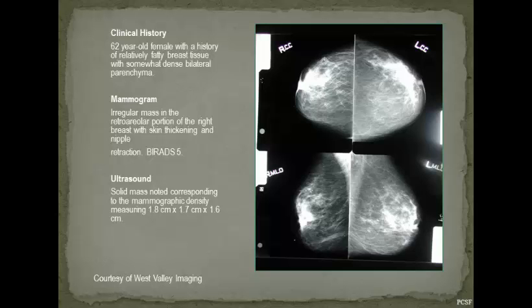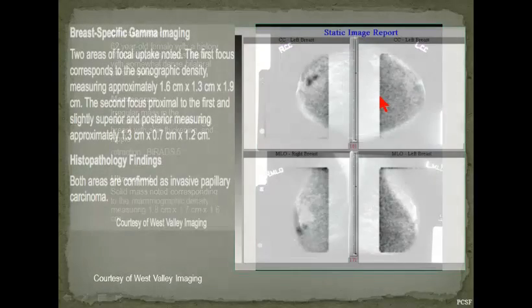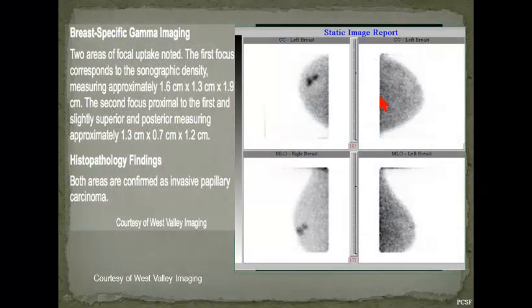I didn't realize this case was still in here. This is obviously one of our older cases. This is still film screen mammography, but the patient has an obvious anterior retraction of the breast tissue. You can see the blunting here. There's a skin-adhering lesion that's clinically palpable. She has this extending density on the mammogram, and then some things in the contralateral breast that look a little bit weird. And on the molecular breast imaging technique, you can see very easily that there are 2 lesions that can be excised simultaneously.